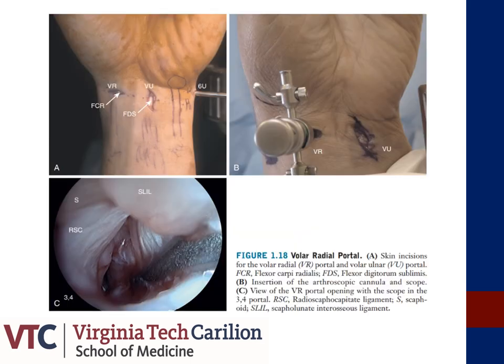The images here represent placement of the VR or FCR portal and the VU portal. The VR portal is developed through the FCR subsheath, and the bottom left picture represents a view from the 3-4 portal confirming the VR portal is developed in the interval between the RSC and the long radiolunate ligaments. The image in B demonstrates the extended incision necessary when developing the VU portal, as there is no safe zone due to numerous cutaneous nerve branches.